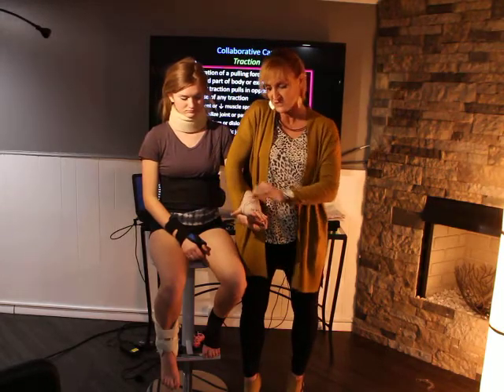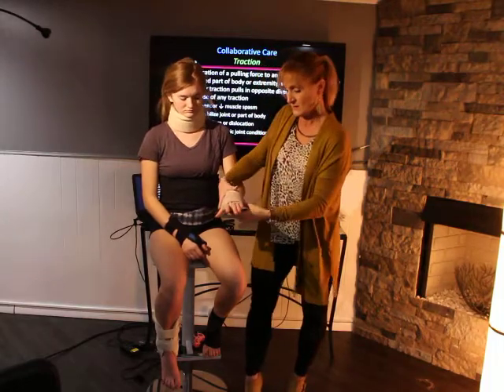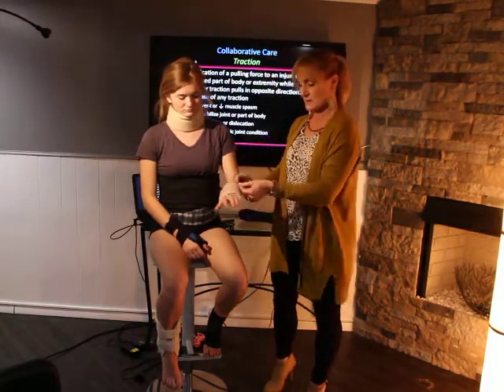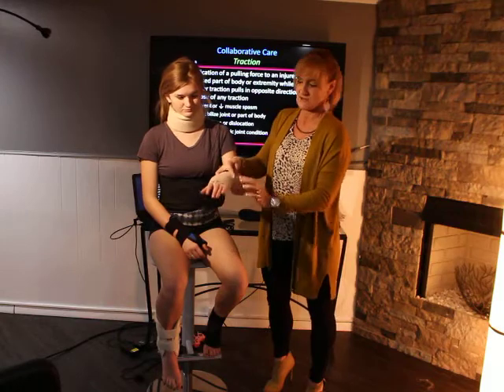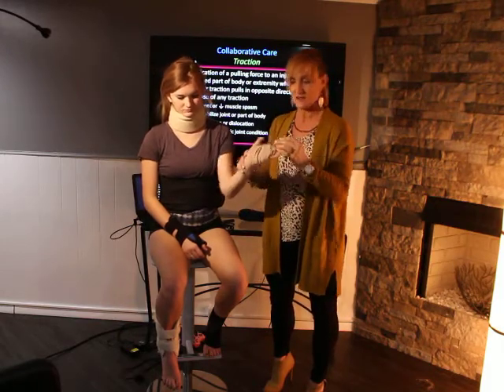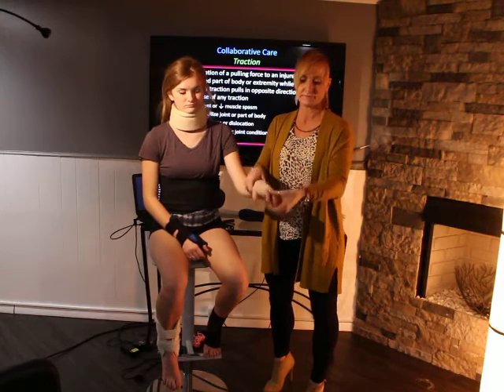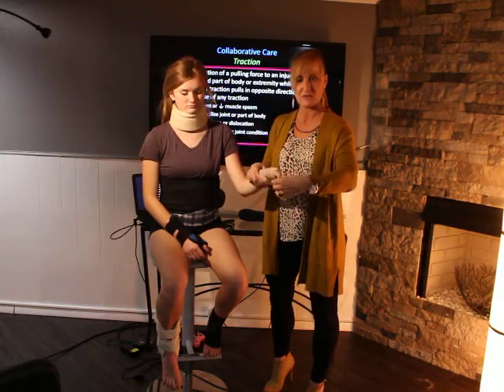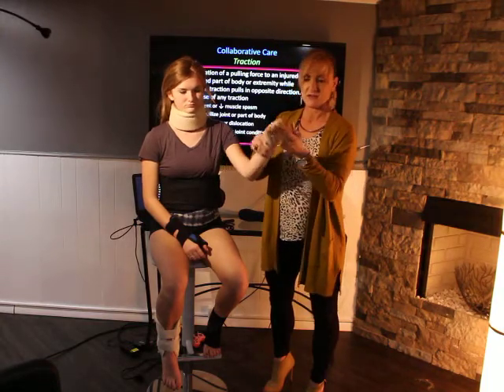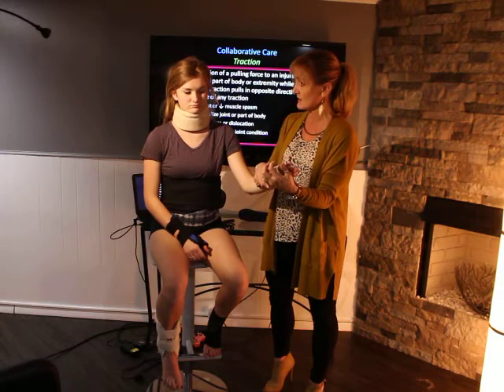Now what I'm doing is I'm just securing this little part in there. Go around here, back up, and then you would secure it. And they have those little clamp things, little Velcro things. And now what I've done is I have given this a lot of support. I have immobilized both the finger and the thumb. I'm going to have my patient keep their arm up. I'm going to ask your patient, does that feel okay?